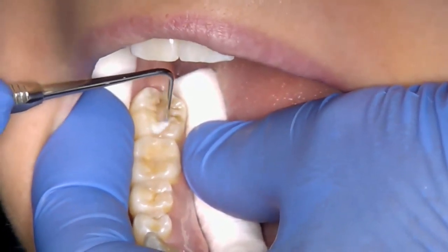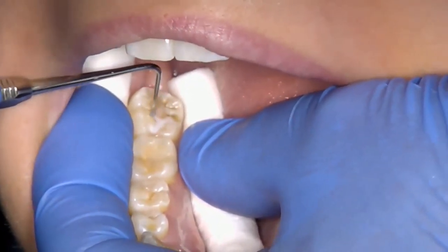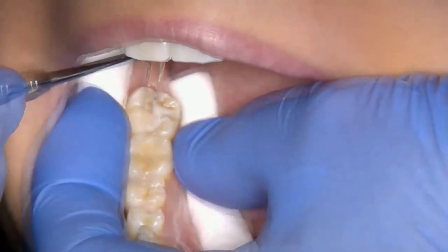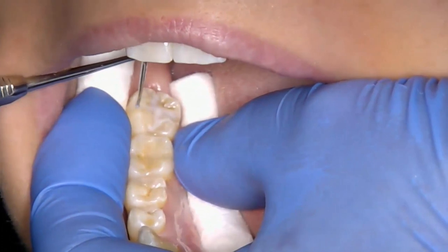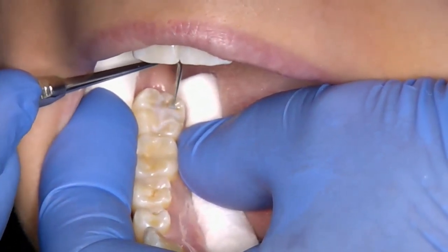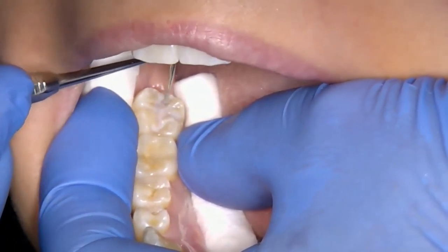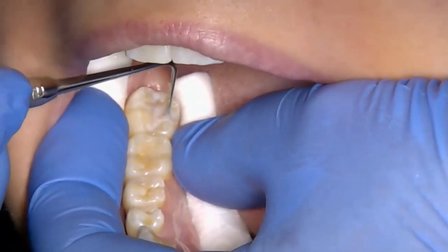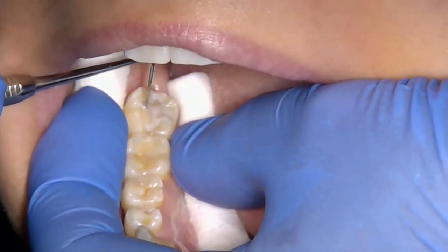Again check that moisture control is still effective before you proceed to the next step. Using a Dical applicator or other suitable instrument, apply the fissure sealant resin to the fissures of the tooth including the buccal pits, gently drawing the resin into all the fissures to be sealed with the applicator. Take care not to overfill or introduce air bubbles.